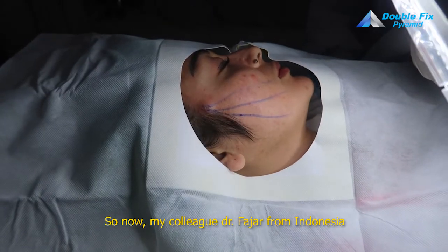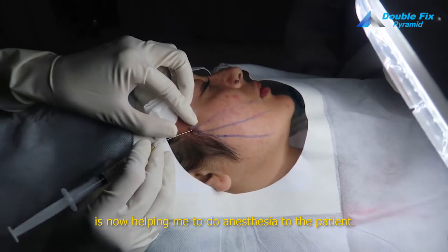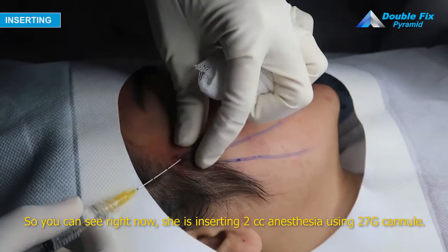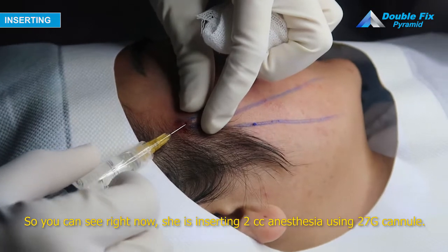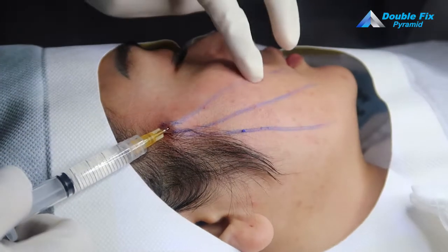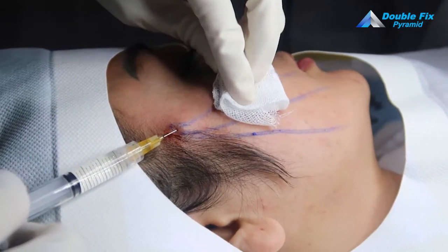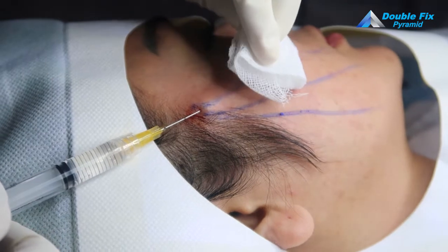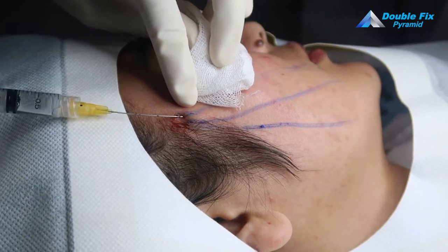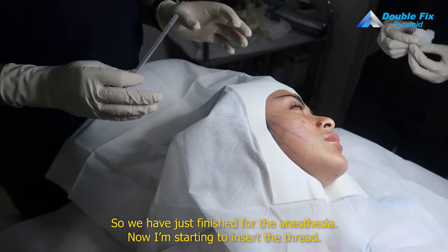So now my colleague Dr. Paja, also from Indonesia, is helping me to do anesthesia for the patient. You can see right now she is inserting tumescent anesthesia using a 27G cannula. We have just finished the anesthesia.